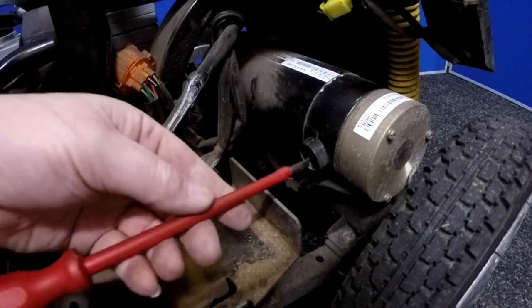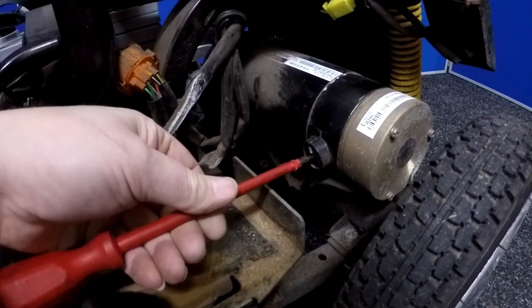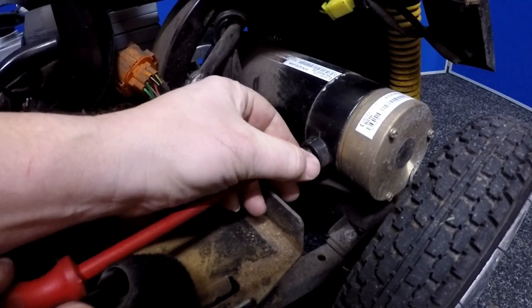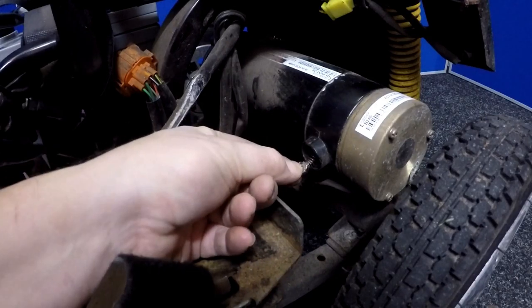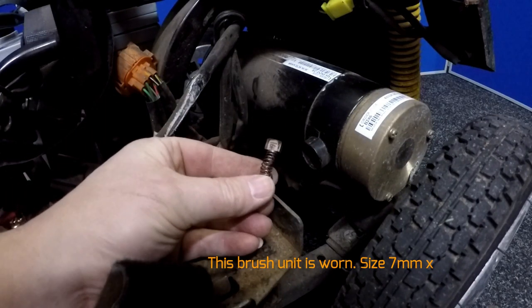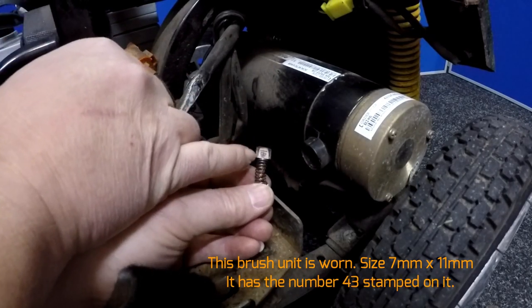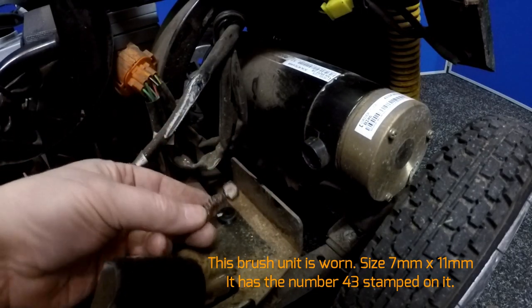So I'll just remove the dust cover here — oh, it's tight. Let's have a look and see what's happening here. I think we can see that this brush unit — it's a 43 — is well worn and there's also kind of burn marks on here. So that's a worn brush unit.